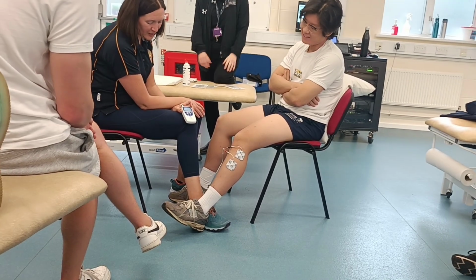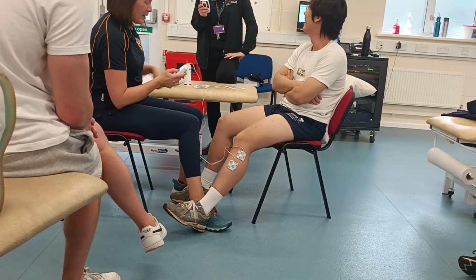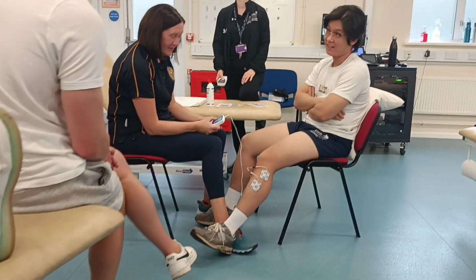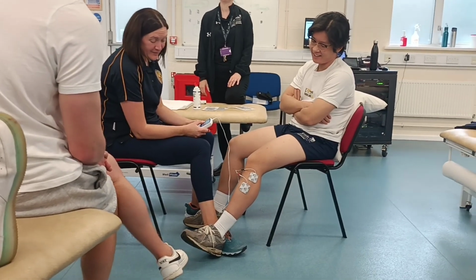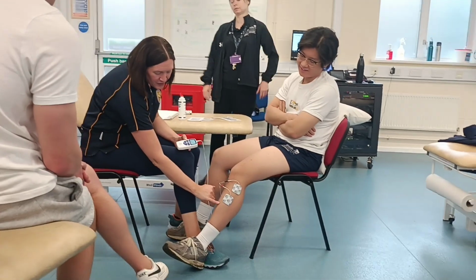Oh, panic over. There we go. Machines are working. It's okay. Oh, yeah, maybe not that one. Or maybe not the electrode. I think it's the electrode. I'll try that. Yeah. And you can see we've got a nice contraction on that muscle.